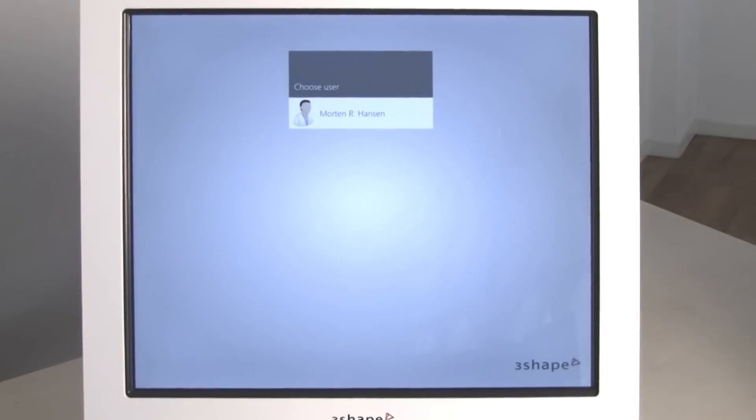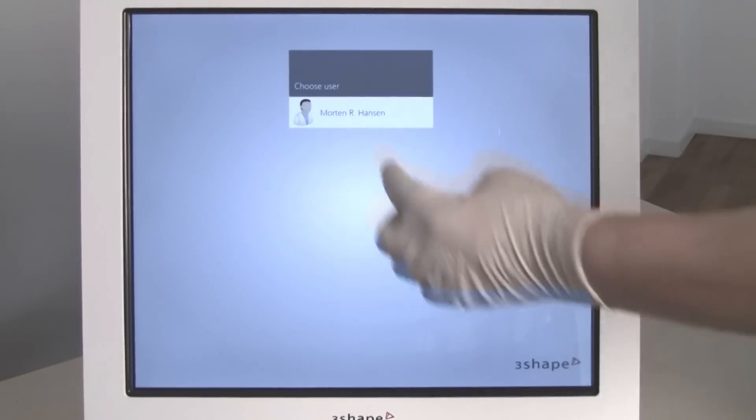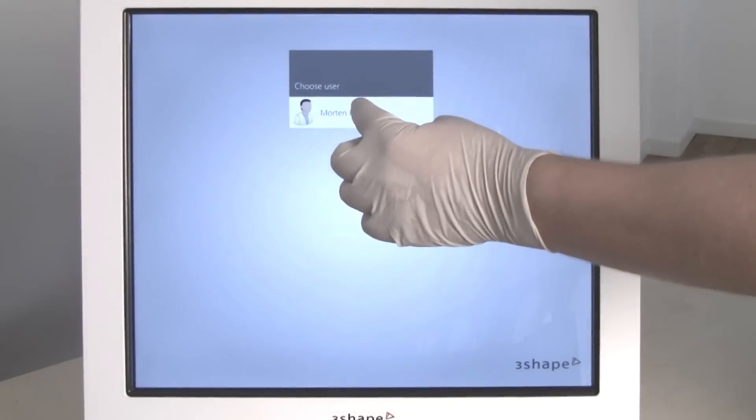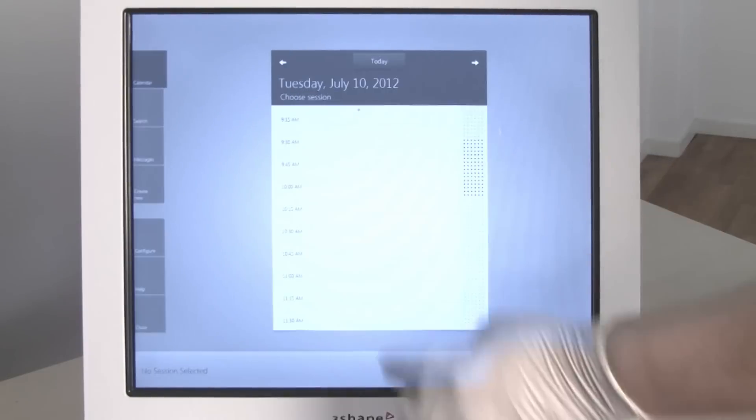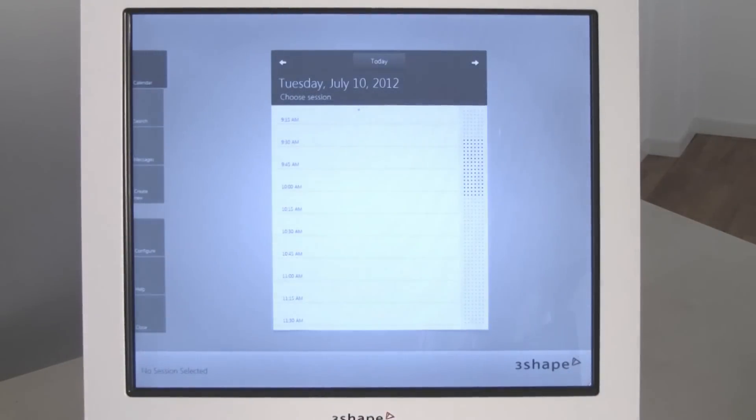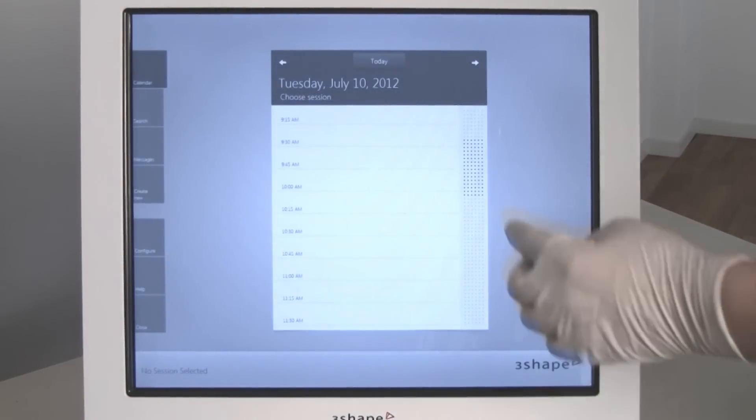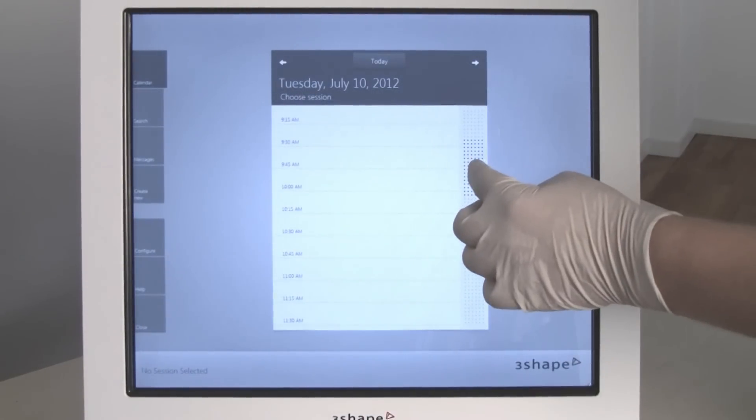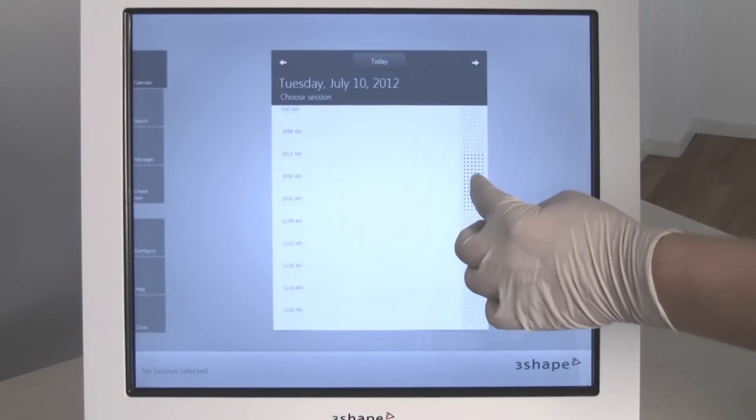To start a job, the dentist logs in by pressing the button showing his or her name. Find a time slot for the patient and click to create a new case.